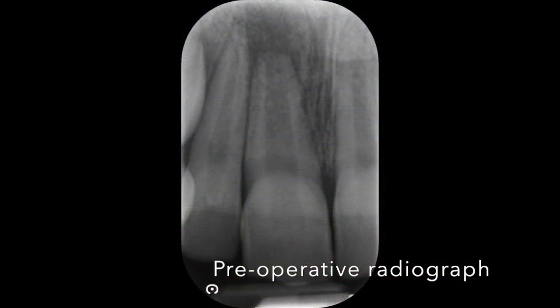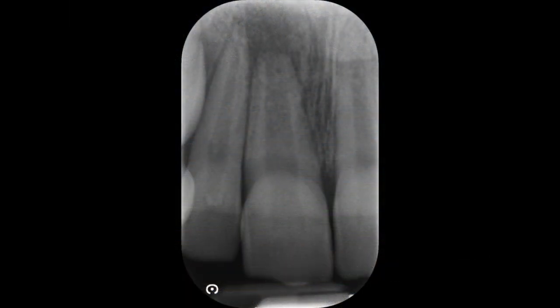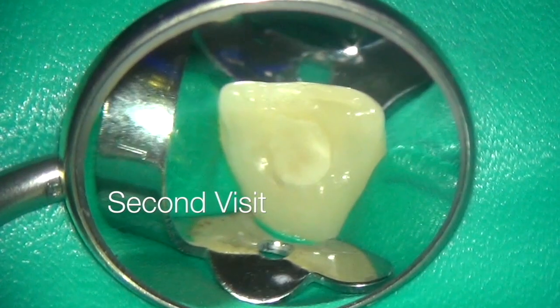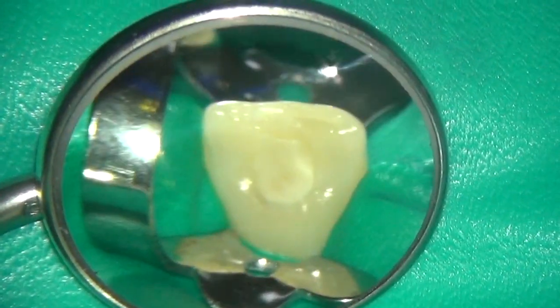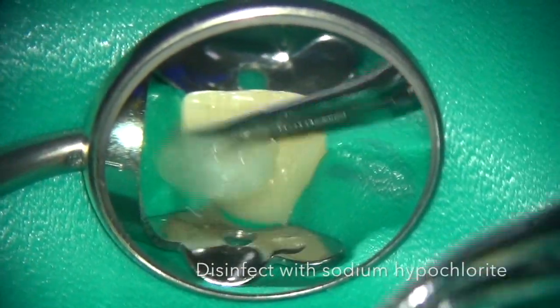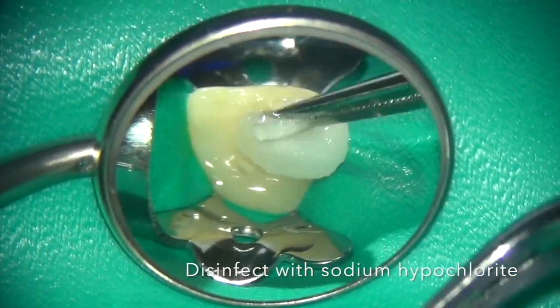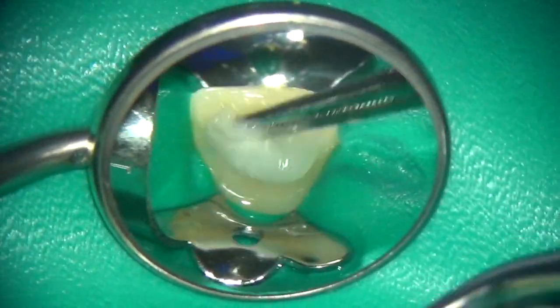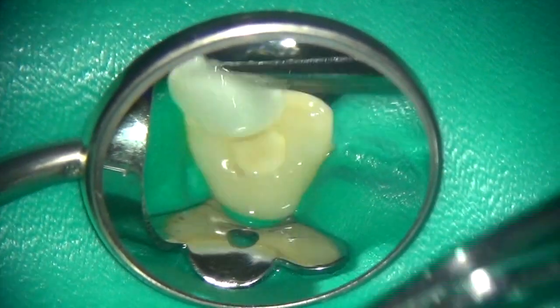So in the first case, we can see an immature central incisor with an open apex and periapical abscess. We're joining the case at the second visit where the calcium hydroxide dressing is being irrigated from the root canal using sodium hypochlorite and EDTA before a blood clot is induced and sealed in place using biodentine and composite in the access cavity.